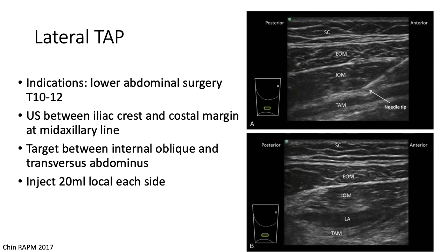The lateral TAP block can be used to cover incisions in the lower abdomen from T10 to T12. With the patient supine, the ultrasound is placed between the iliac crest and the costal margin at the mid-axillary line. The three muscles — external oblique, internal oblique, and transversus abdominis — are identified and the needle is advanced to the target. The correct location can be confirmed with saline; the plane should appear dark when you inject local in the right place, whereas an incorrect injection into the muscle will appear hazy.